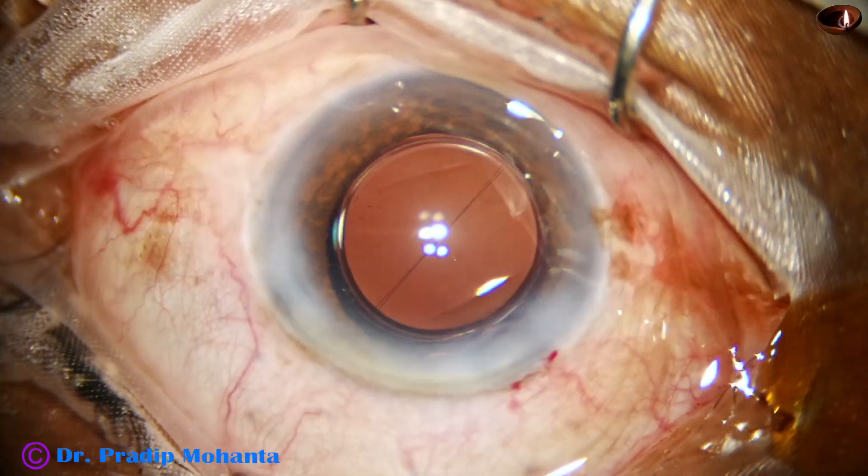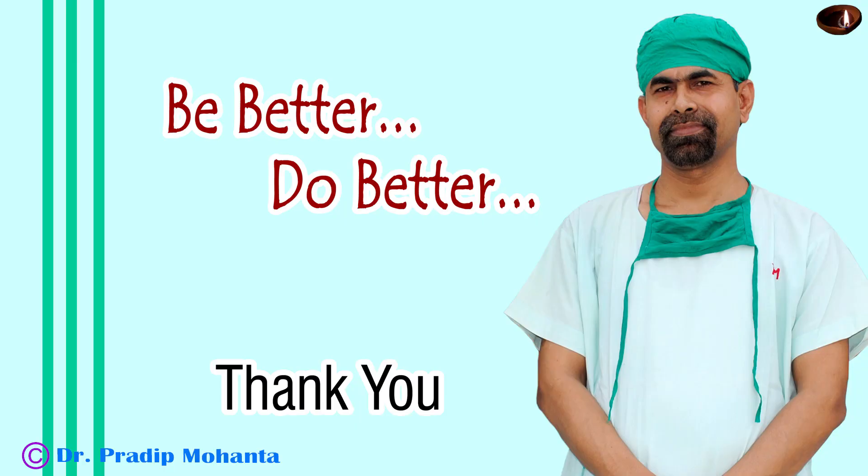So here we conclude the case. Thank you very much for your attention. To summarize: whenever air bubbles form, we have to come back to position 2, use irrigation and aspiration, remove the air bubbles, and continue the surgery.